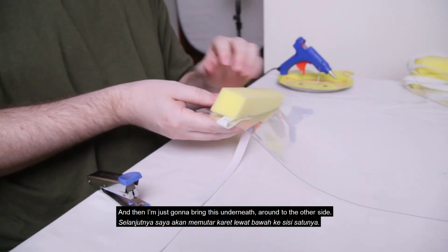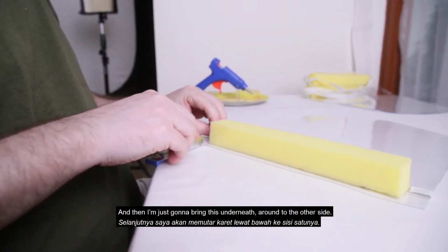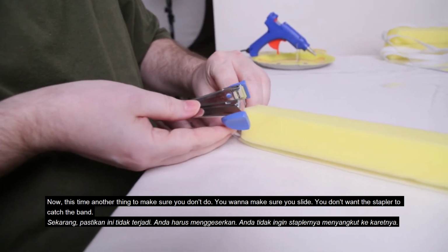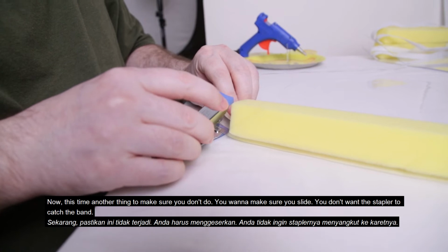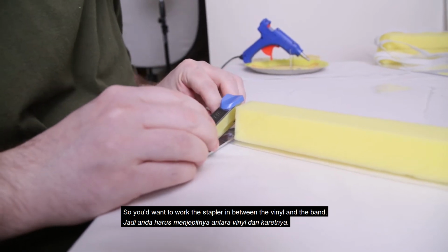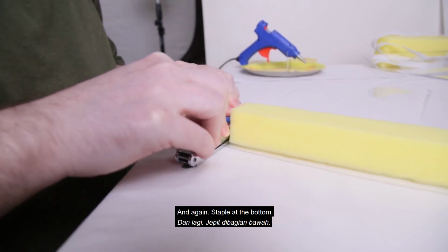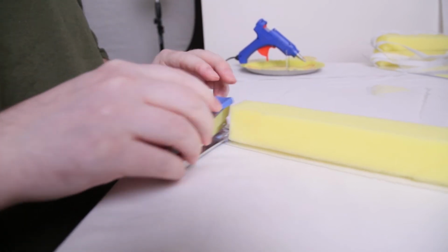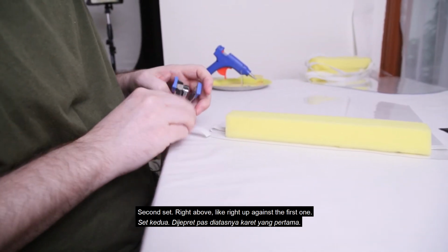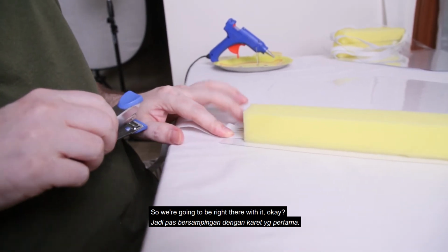Okay, and then I'm going to just bring this underneath, around to the other side here. We're going to do the same thing over here on the other side. Now, this time, another thing to make sure you don't do, you want to make sure you slide. You don't want the stapler to catch the band, so you want to work the stapler in between the vinyl and the band, and again staple at the bottom. That's the first set. And then we're just going to do it again for the second set, right above, like right up against that first one. So we're going to be right there with it.